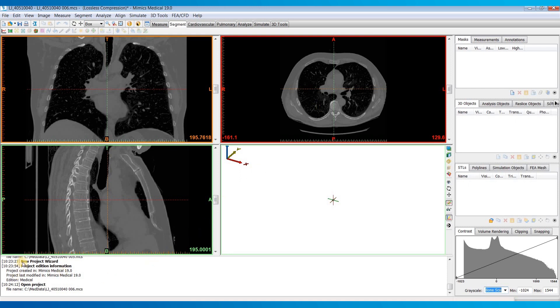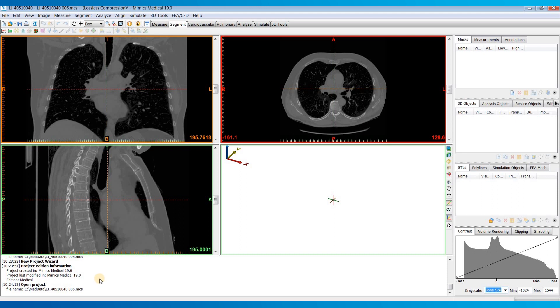Down here at the bottom is our logger which will keep track of any actions that we perform. It will also keep track of any undos that you do. So inevitably you might make a mistake, and as you hit CTRL Z or the undo button it will let you know which action you're actually undoing, just to make sure you're not undoing something that you actually don't want to.